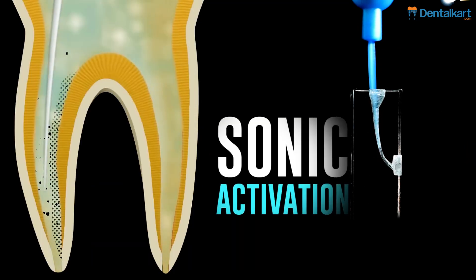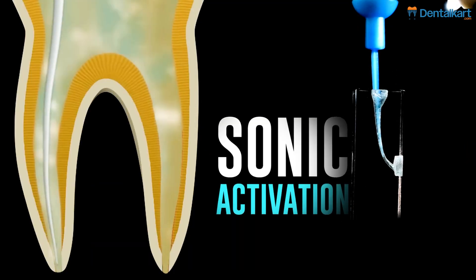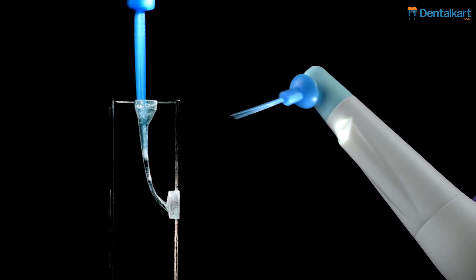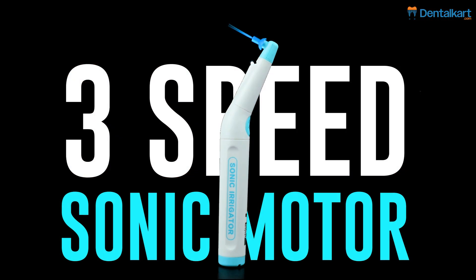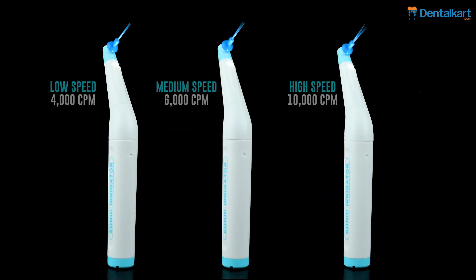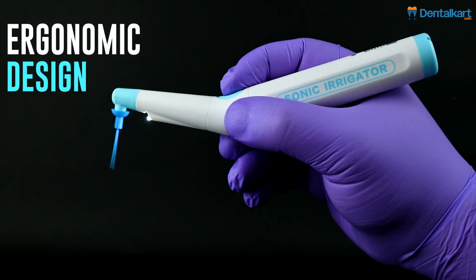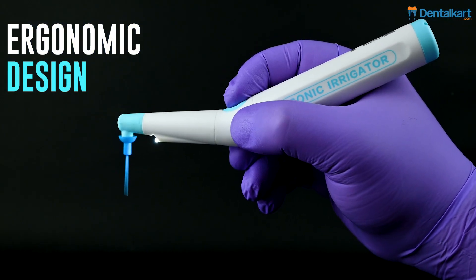Features: Sonic activation enhances cleaning and disinfection in root canals. LED illumination improves visibility for precise treatment. Three-speed sonic motor with customizable speed settings for varied procedures. Ergonomic design with a contra-angle handpiece for easy access to posterior teeth.